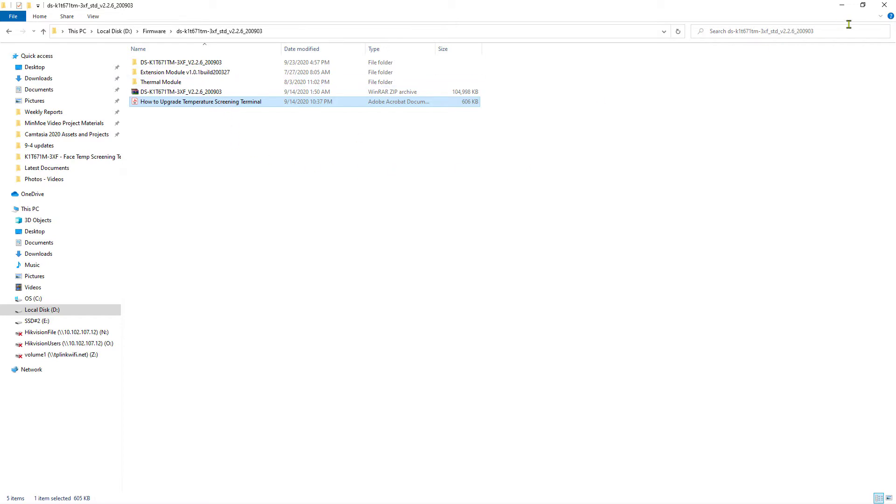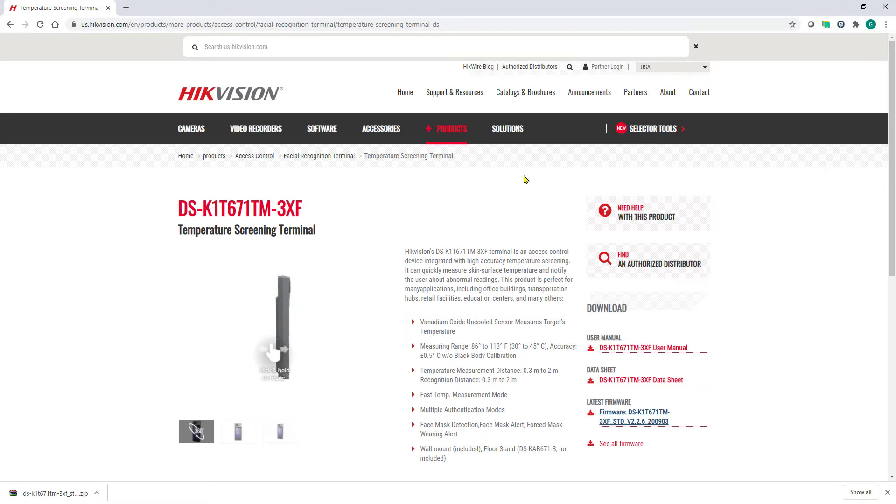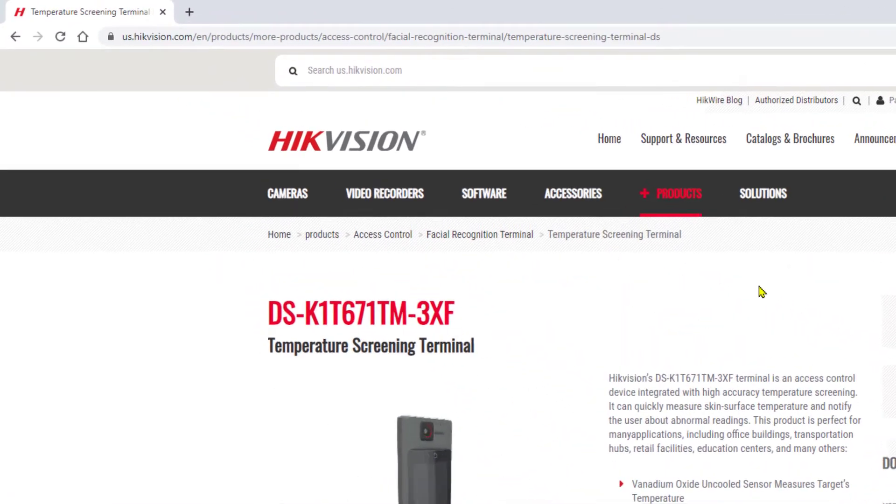So now we've got all the firmware files that we need. Now it's time to make sure that we have the right client. In this case, I'm going to be using IVMS 4200.